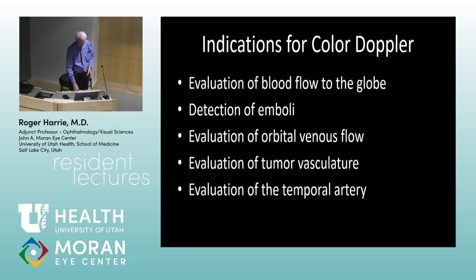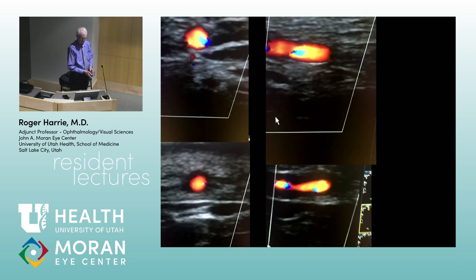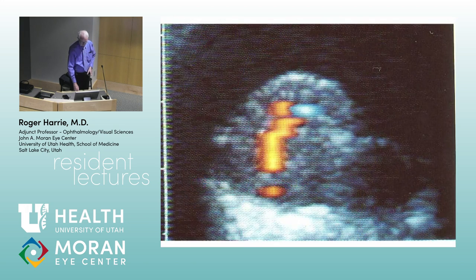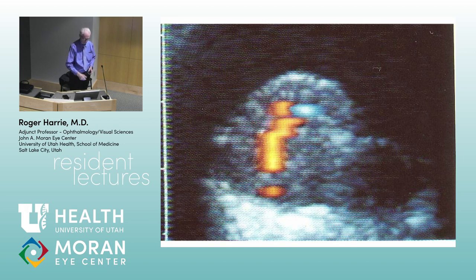You can look at tumor vasculature — inside a melanoma I can actually see real-time blood flow as a rapid little flicker inside the lesion without Doppler, just with real-time B-scan. Here's a carotid-cavernous fistula case: a patient with eye aching at night and tortuous vessels. The Doppler confirms it — a very dilated vein that is arterialized, with flow showing as red instead of blue because arterial flow is going through the vein in reverse. That's why the pressure builds up and the vessels are congested.